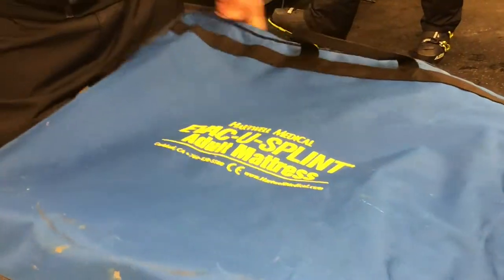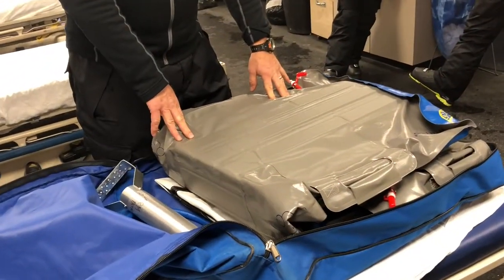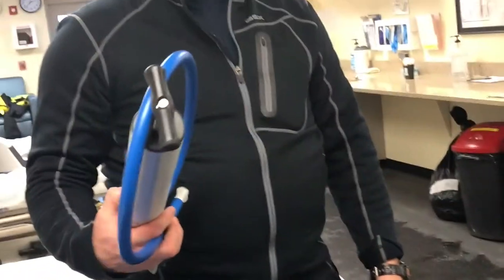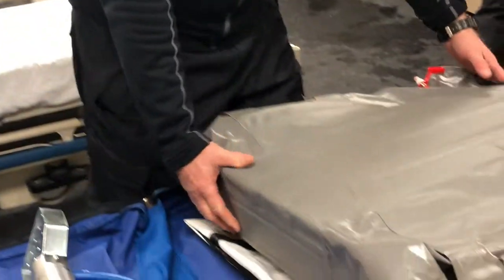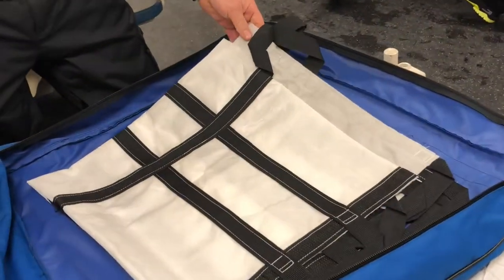Once we've obtained the vacuum splint from the storage location, we take it to the place we're going to use it and open up the packaging. Let's take a look at what we have packaged with the vacuum splint here at Mad River Mountain. Unzip and open — on top is our vacuum splint. There is a pump for evacuating the air out, and with ours in the kit, we're also keeping a mega mover.